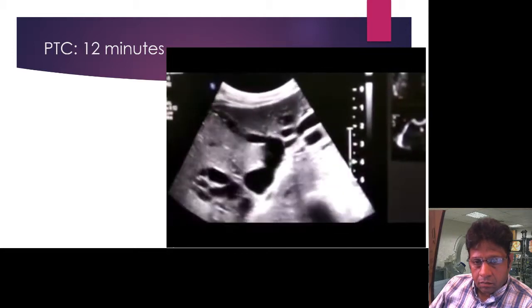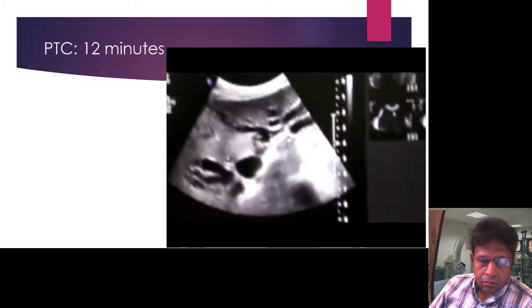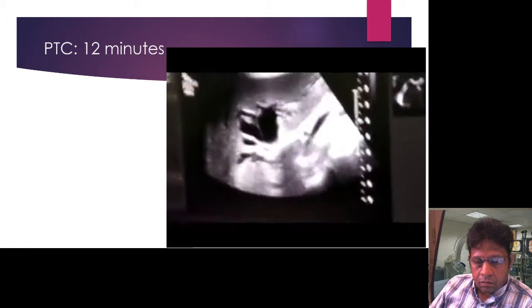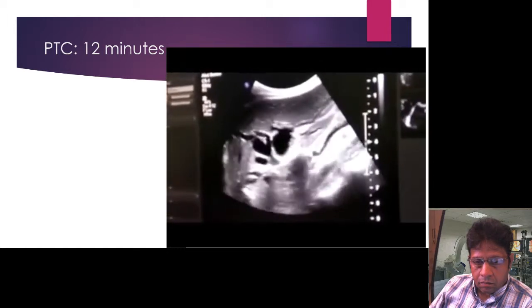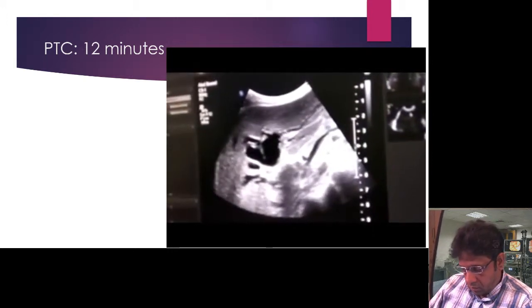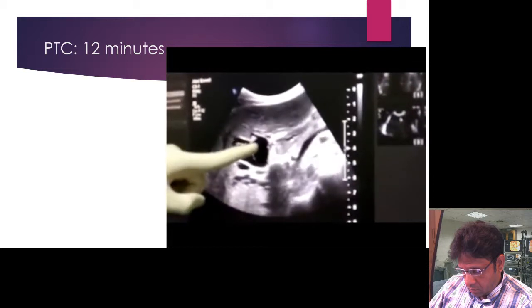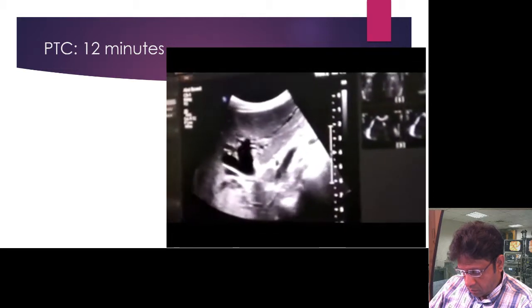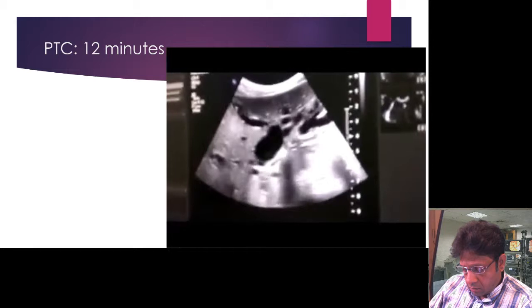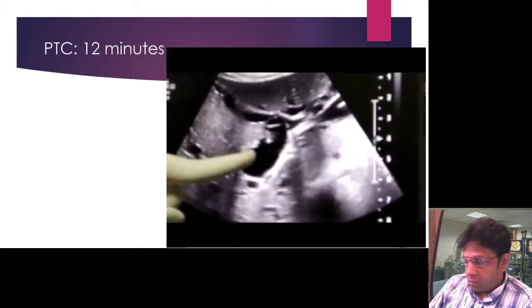Once again. A small push, and after pushing that, we have actually reached the biliary duct, the dilated biliary radicle. There we can see the movement of the needle tip here. To confirm this, we will aspirate and we will see the free flow of bile. Yeah, we are here. Here you can see the clear needle tip inside the lumen of the left hepatic duct.